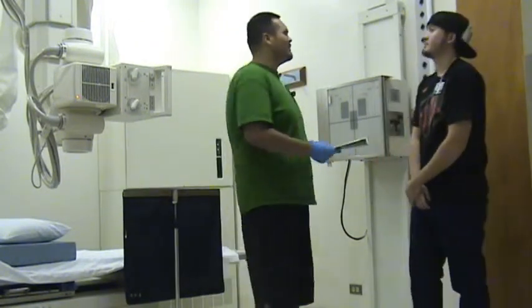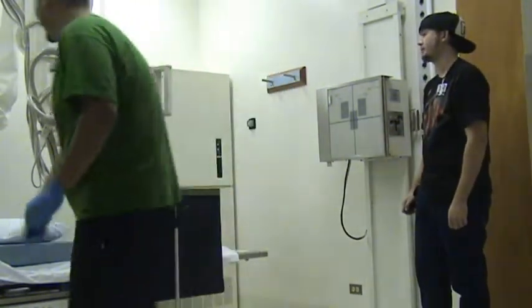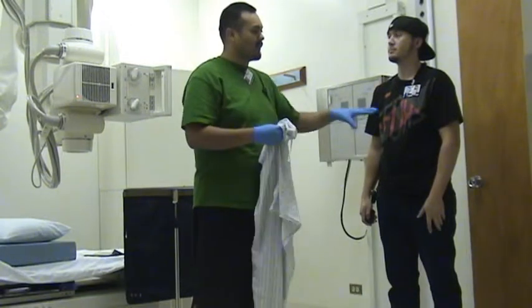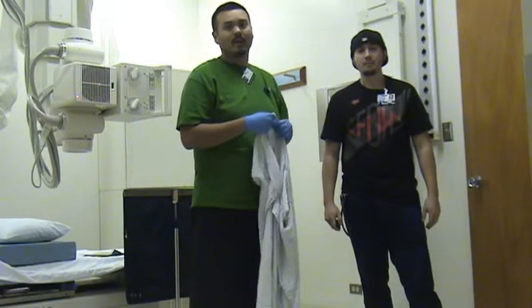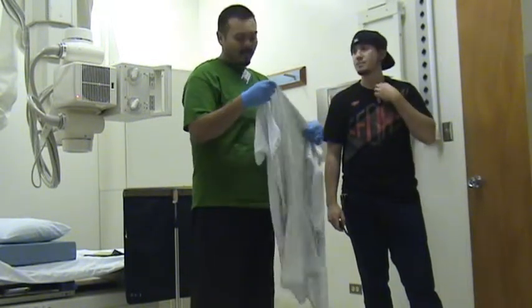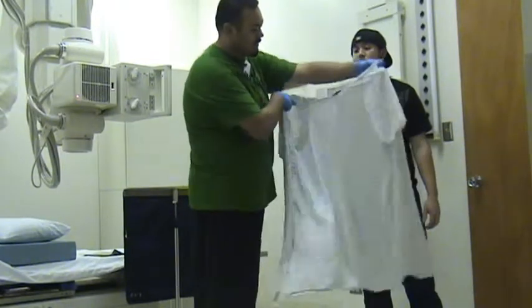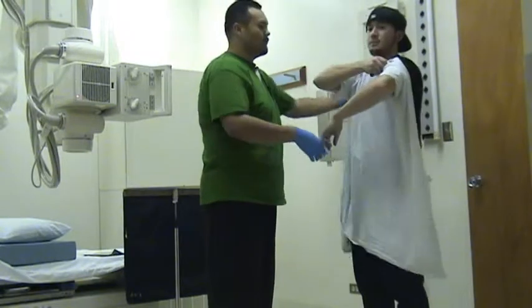All right, sir, if I can have you switch into this gown. With patients that come in with shirts that have graphics and logos, you want to make sure that they remove them. You never know if they might show up on the x-ray or not. Make sure they don't have any necklaces. If my patient today was a female, then make sure to remove everything from the waist up, including the brassiere and anything like that. But sir, go ahead and put this gown on with the open side towards the back. Perfect.